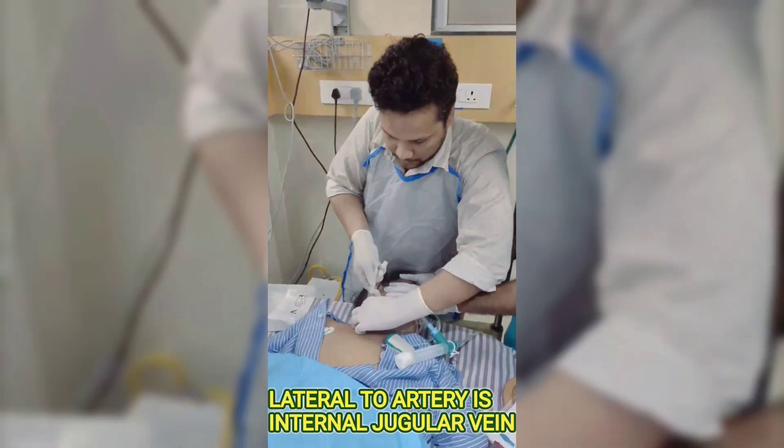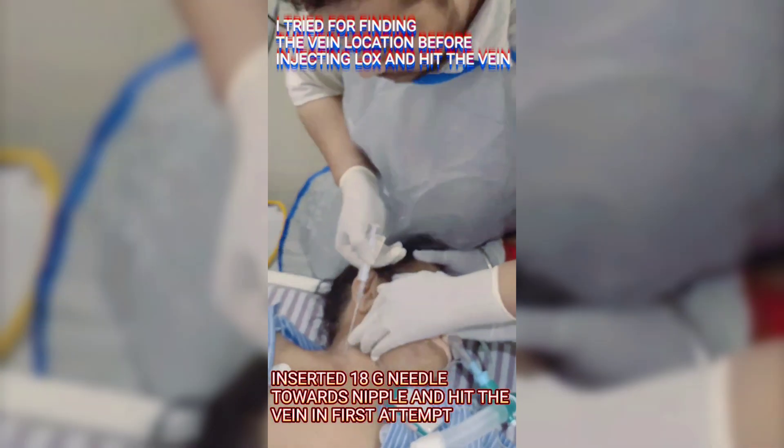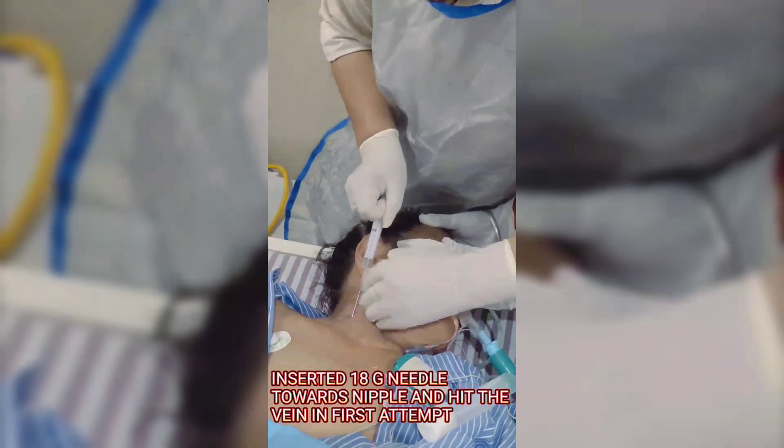Feel the pulse and mark the location. The internal jugular vein lies lateral to the artery. Insert the 18G needle directed toward the nipple and aim to hit the vein on the first attempt.